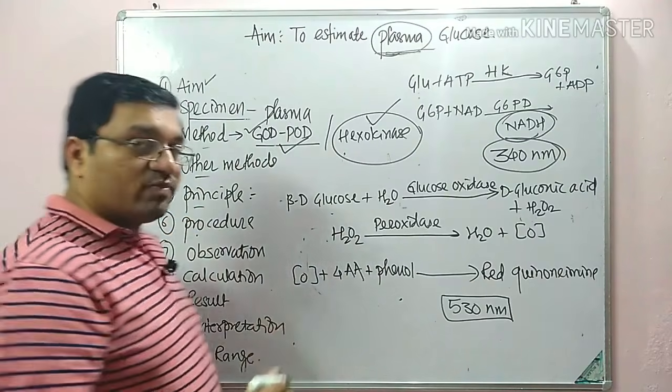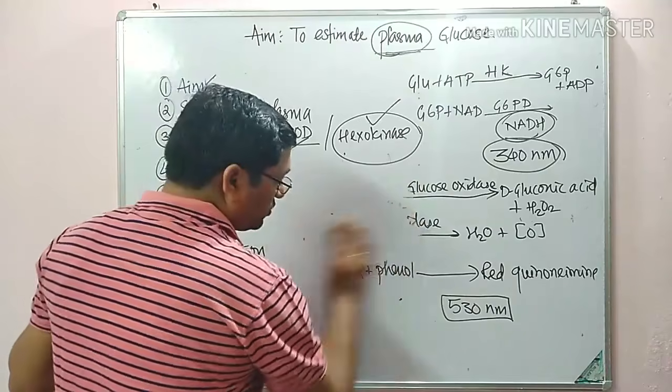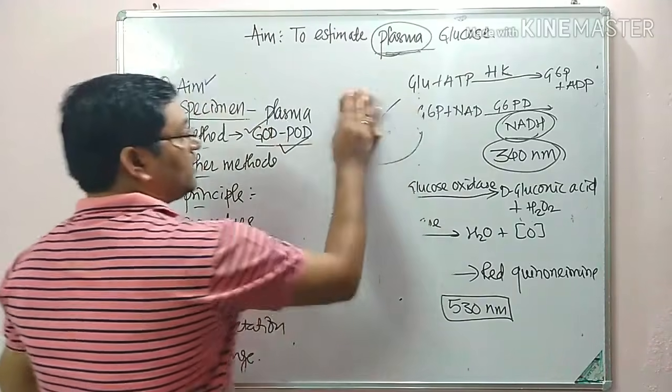Now we'll discuss the principle of Folin method in short, because in some institutes this Folin method is still in use.